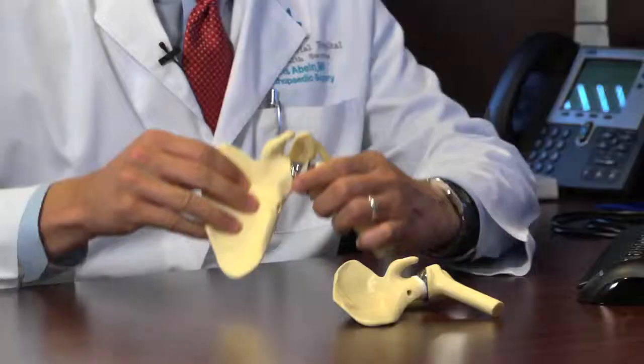Traditional total shoulder replacement essentially resurfaces the normal human anatomy, which is on the humerus, a ball, and on the glenoid side, a socket. So we resurface that and keep the native anatomy and essentially match it. It requires that the rotator cuff be present to stabilize the shoulder and restore the ability to lift your arm.